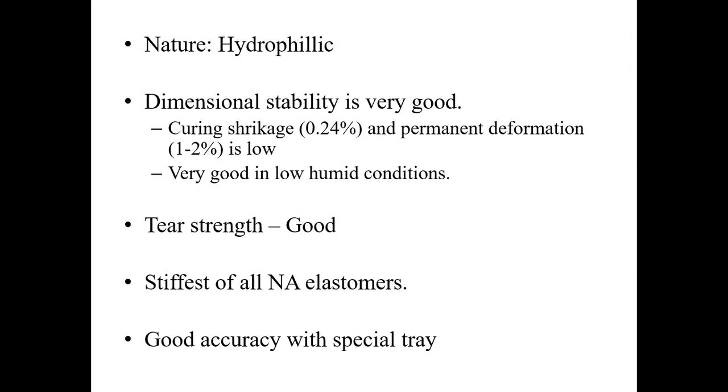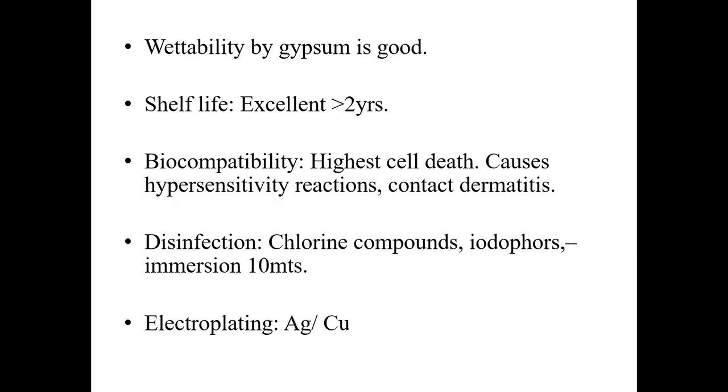The tear strength of this material is also very good, and this is the stiffest of all non-aqueous elastomeric impression materials. This shows good accuracy with a special tray. The wettability of this material with gypsum is also very good because it is hydrophilic in nature. The shelf life of this material is excellent, more than 2 years.